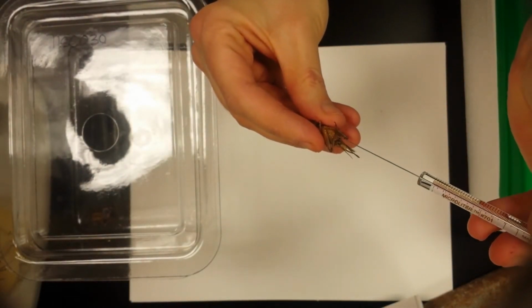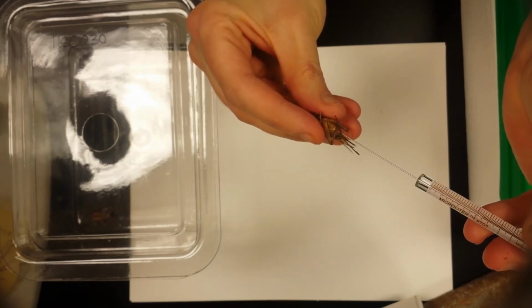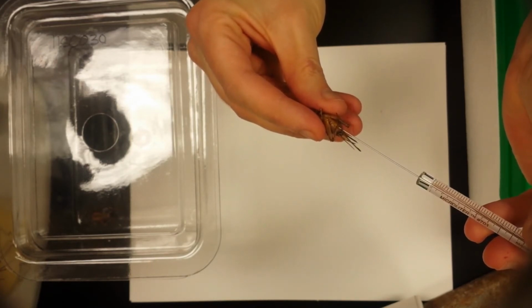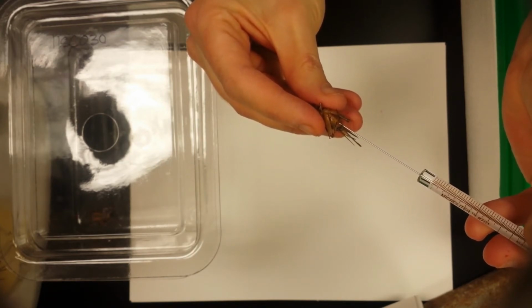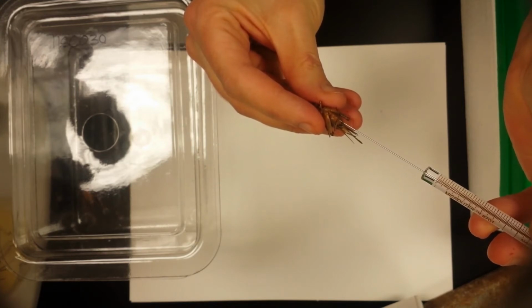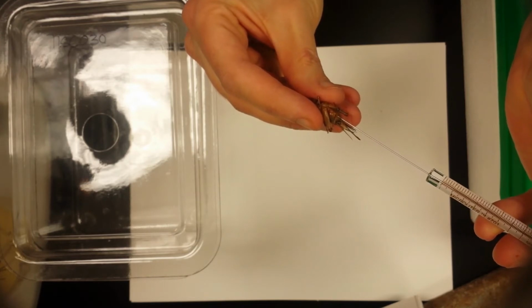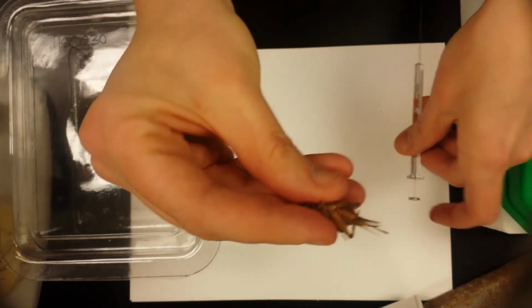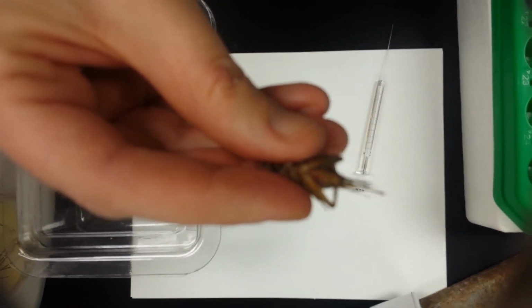I'm going to stick this between segments in her abdomen, and I'm going to just slowly add that 5 microliter volume of amaranth. You can actually see she's starting to turn a little bit pink as I add that in to her abdominal cavity. Okay?